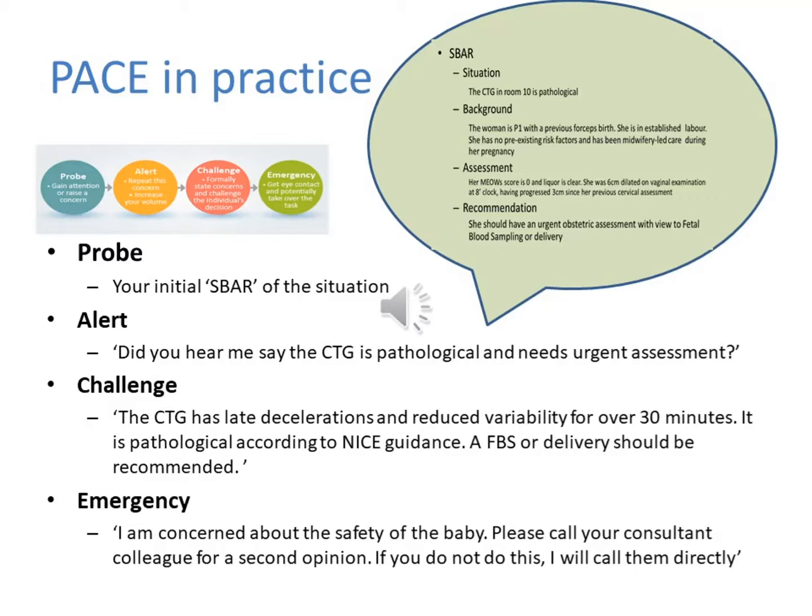However, if the registrar did not attend to perform the assessment, the next would be the alert. Did you hear me say that the CTG is pathological and needs urgent assessment? If the action is still not carried out, the next step would be the challenge. The CTG has late decelerations and reduced variability for over 30 minutes. It is pathological according to the NICE guidance. A fetal blood sampling or delivery should be recommended.